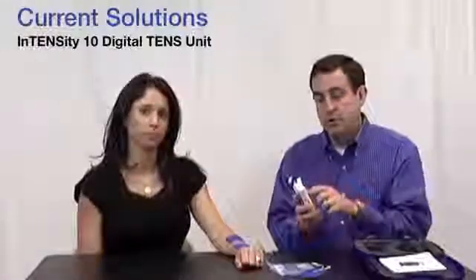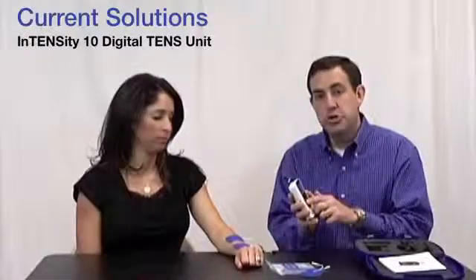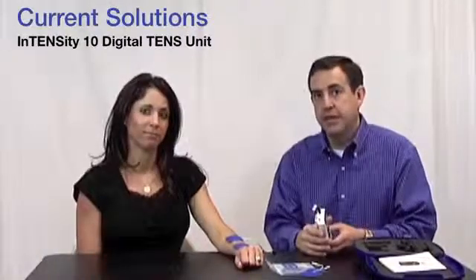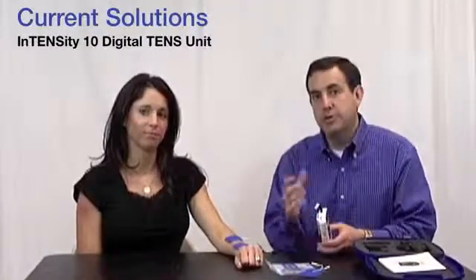And you're done — simply done. You choose the affected area, turn it up until it's strong but comfortable, and you've already used the Intensity 10. You should be getting pain relief right when you can feel that TENS stimulation. Thanks again, and again — the Intensity 10 by Current Solutions.